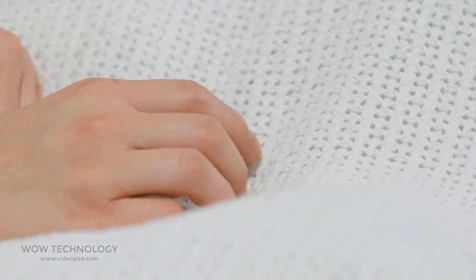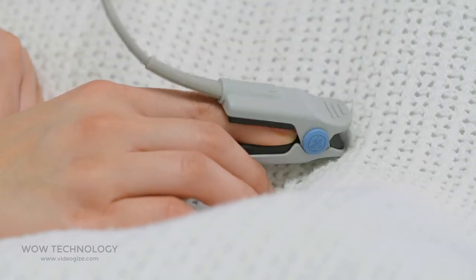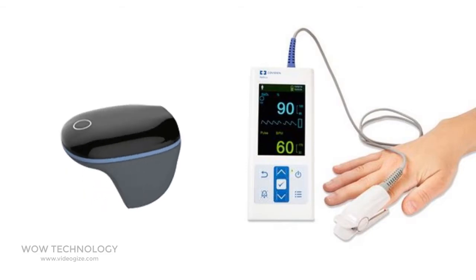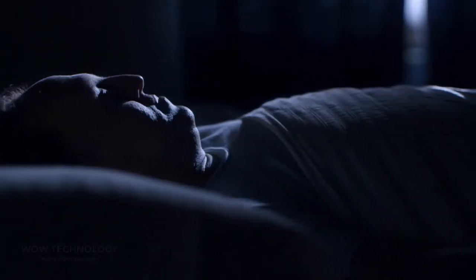Most pulse oximeters usually have what's sometimes called a duck bill sensor, which clips onto the end of your fingertip, and then a wire sends this information to a screen for readout. This design has been around for decades, but with the O2 ring, the device is suitable to wear in bed all night without falling off, and comfortable enough not to disturb your sleep.